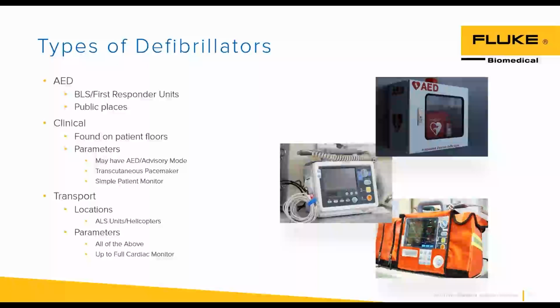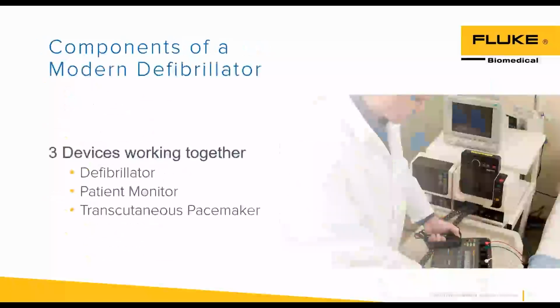So if you look at the defibrillator, there's three main components built into a modern defibrillator. We went back through the archives, and I remember this picture, and I want to pull it back. This is a really cool picture of a defibrillator. I remember working on these. That's how old I am, unfortunately. If you look at this unit, you'll see the defibrillator and the patient monitor on the left, those two pieces came apart. So you can carry just the patient monitor side, or just the defibrillator side.